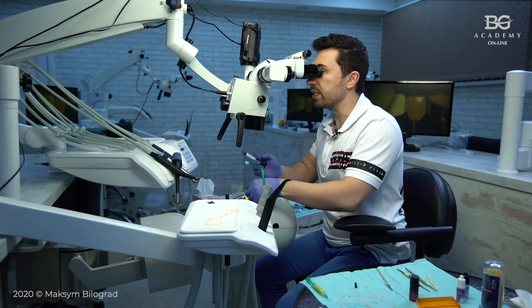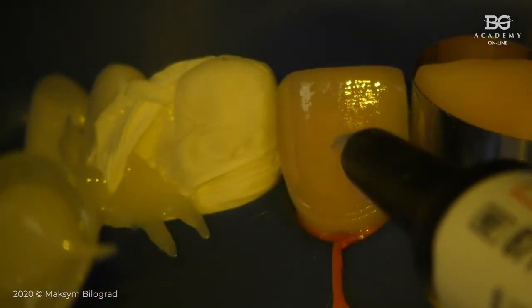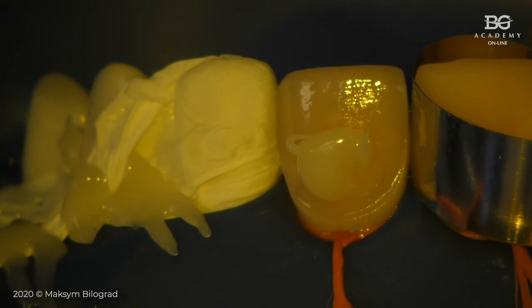And now I will apply some resin cement. What type of resin cement to use we will discuss a little bit later. Just let me show you some clinical steps. We apply some cement on the veneer. We apply some cement on the tooth.